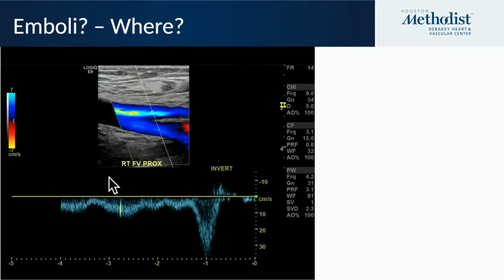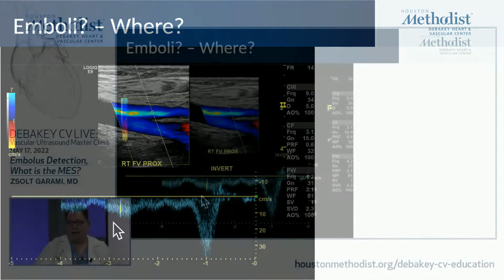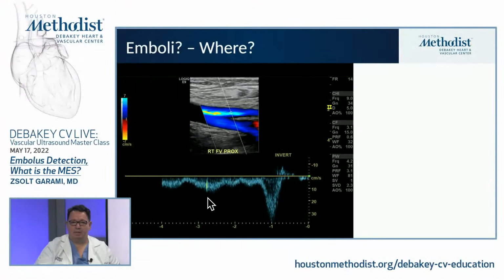One of my first images we saw in the venous study, and this is again a femoral vein, there's a microembolus signal right there. And when we just quickly sent it out to our vascular sonographer group, a few people quickly identified that, again, not just on TCD, but any other duplex, you're able to see that. Duplex is not ideal because your sample gate is small.